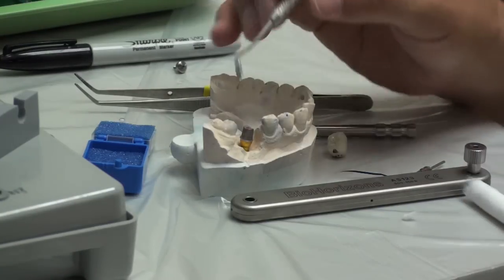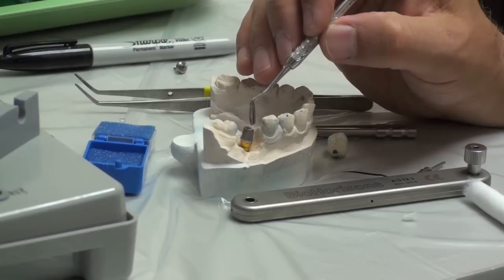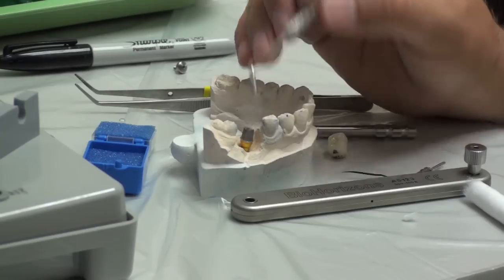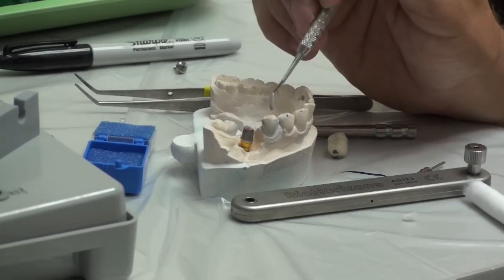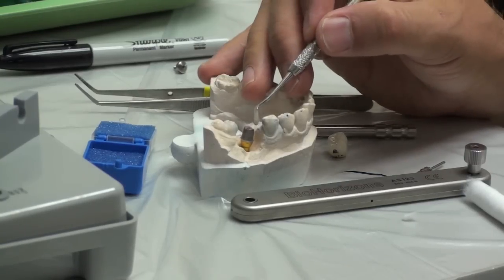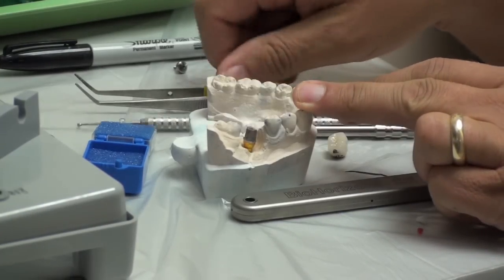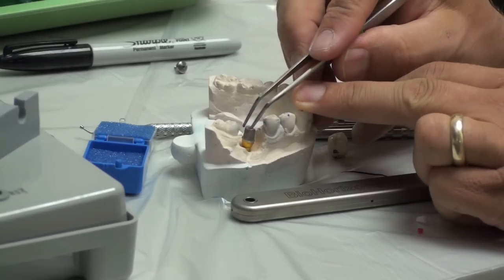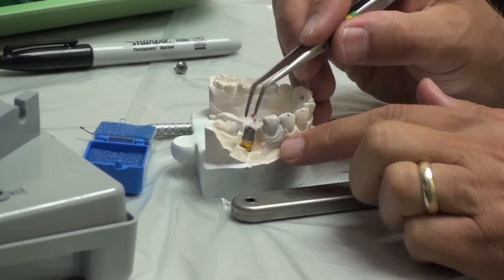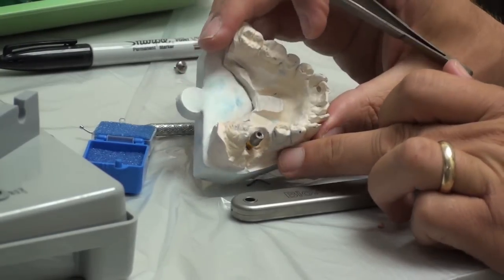The reason we do that is we don't want cement to get into this so that if I need to remove the crown, I don't have hard cement in the screw head that I have to drill out. If I have to drill it out and it's down into the head of the screw, I still can't loosen the thing. So you need the wax to prevent cement from getting into the threads. If you just put cotton in, it sort of keeps the cement out, but the cotton becomes impregnated with cement and becomes essentially a block of cement too. The two layers allow us to easily get back in there and get clean threads.